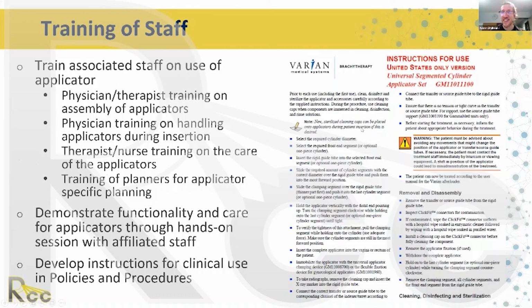Yeah, and I'll just reiterate that point. This is something that doesn't seem like medical physics work, making sure that sterilization knows how to sterilize things right. And I think a lot of us in our careers have sort of skipped over that point pretty quickly, or maybe we didn't communicate very well, and you can end up having applicators broken and that sort of thing. And if you've only got so many applicators, that's a really important point. So definitely make sure that you find that information in your manual. If you can't find it, talk to your vendor and go over to sterilization, find the manager, make sure that that process of sterilization is implemented correctly.